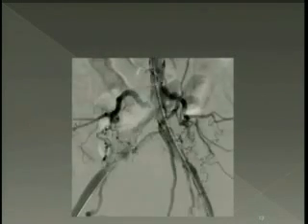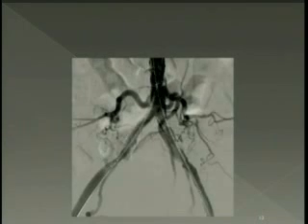So we now bring in 2 stents from both sides. This is again SMART Control by Cordis. 980 on the left, 960 on the right. Now, Michel, the issue is, do we cover the lower portion of the aorta? I think whenever you have come to our lab, we always felt it's good to stay a little bit inside, a few millimeters inside the aorta, because it would be unusual to have typical iliac ostial disease. There would be some disease in the upper portion of the aorta. And this is what we felt.